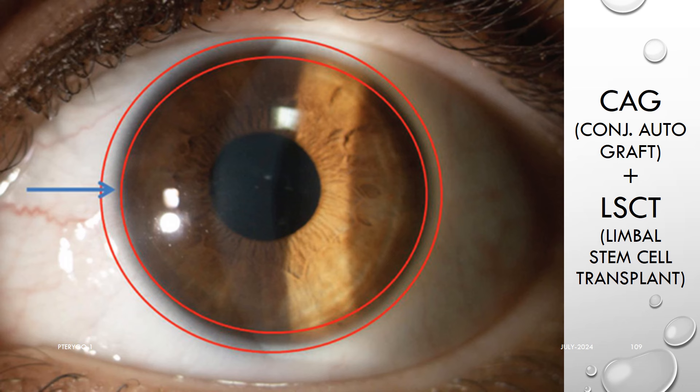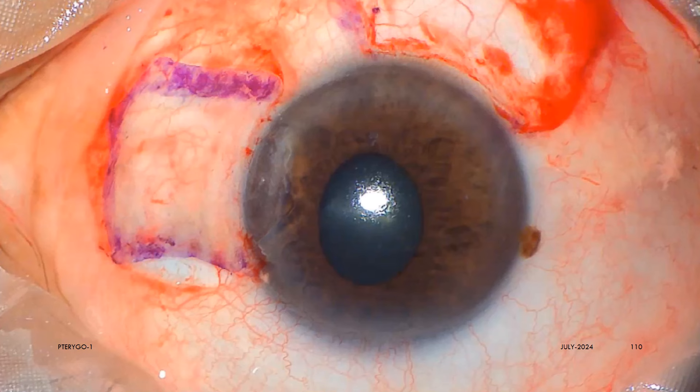So please keep in mind: just taking a free conjunctival autograft is not enough. It has to have limbal stem cells, and the limbal stem cell niche has to be oriented towards the limbus. Also please make sure of the anteroposterior orientation of the graft — the marker pen is a great help here.